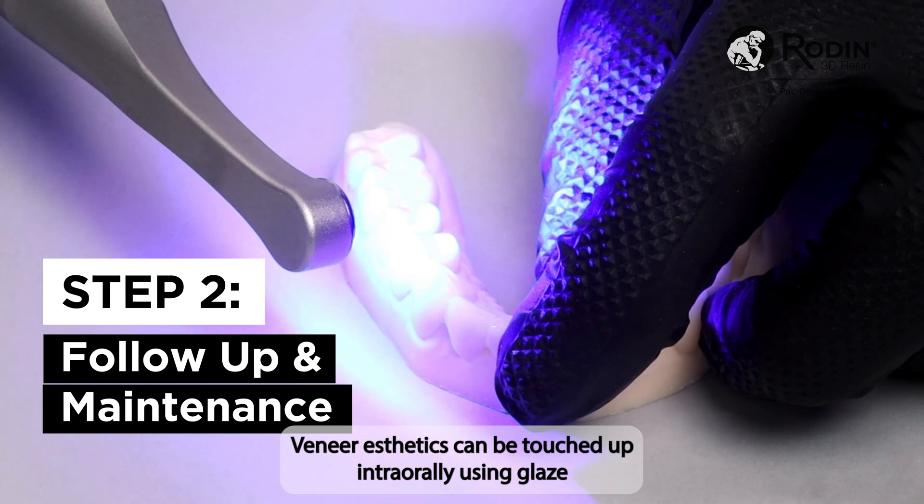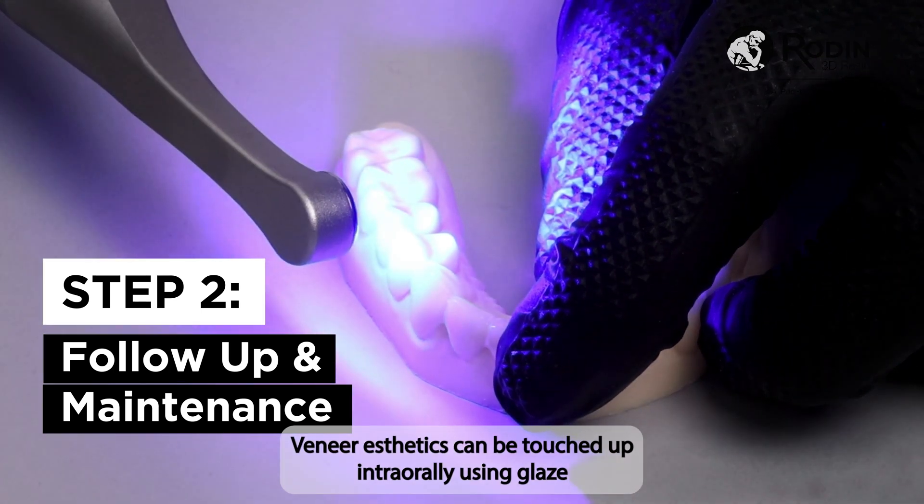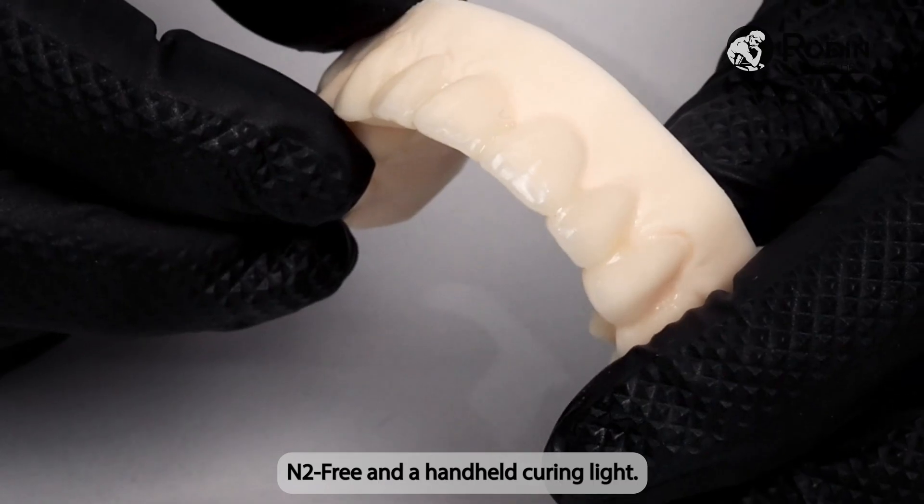During routine checkups, veneer aesthetics can be touched up intra-orally using Glaze N2-Free and a handheld curing light.